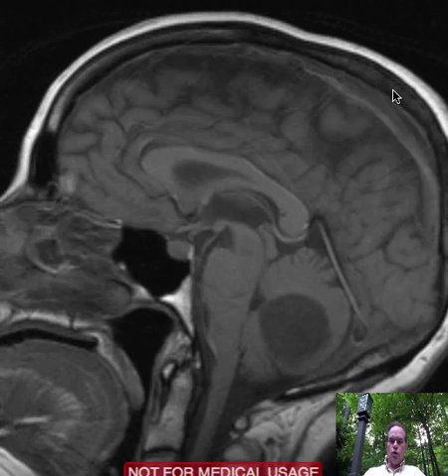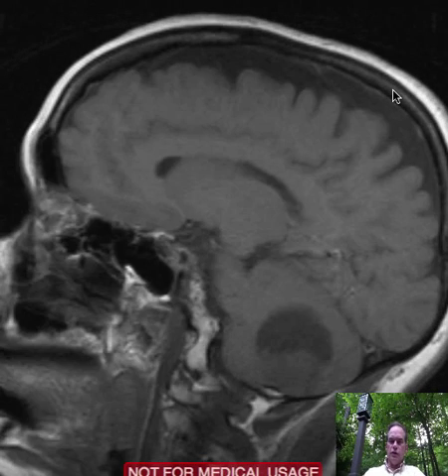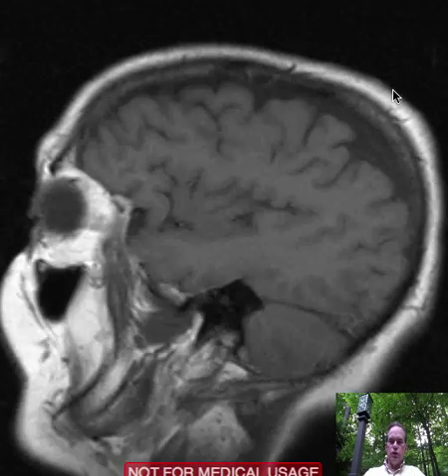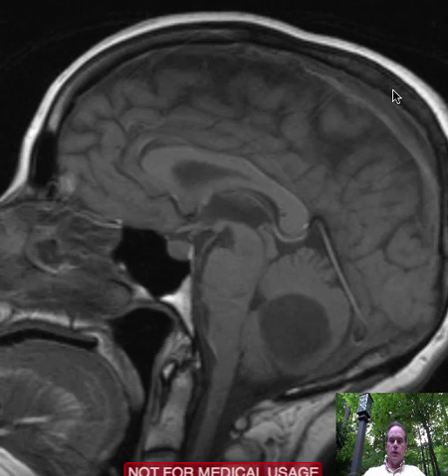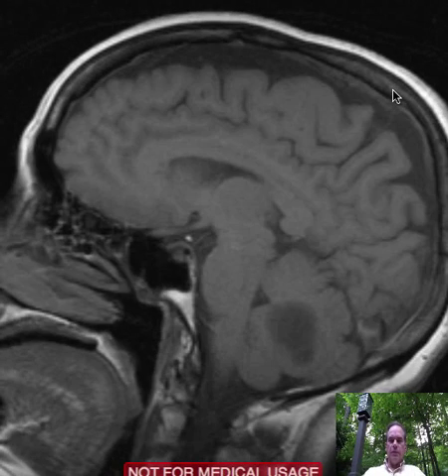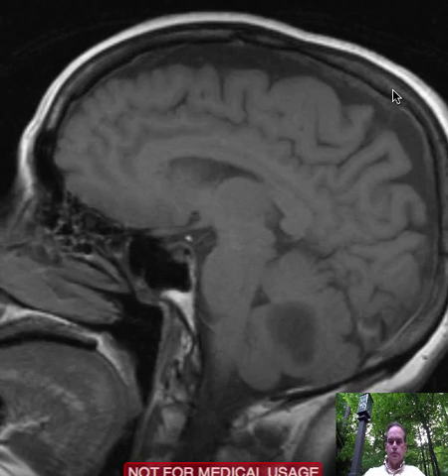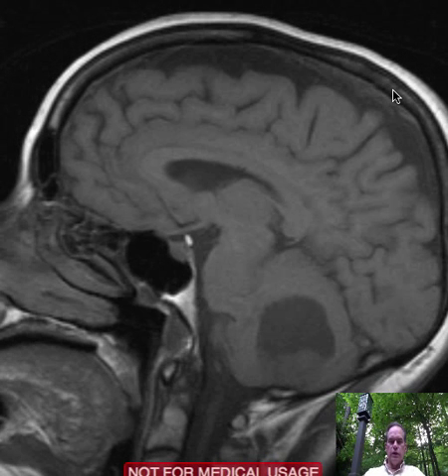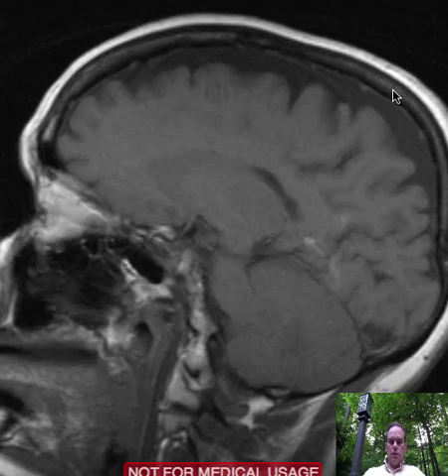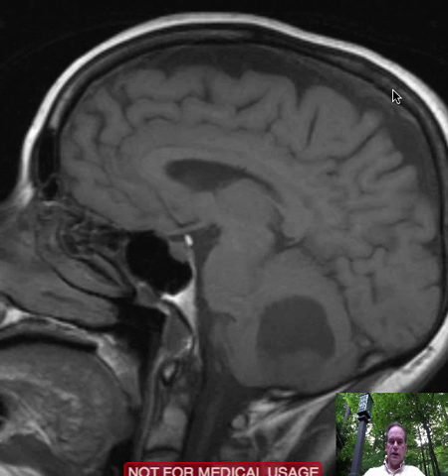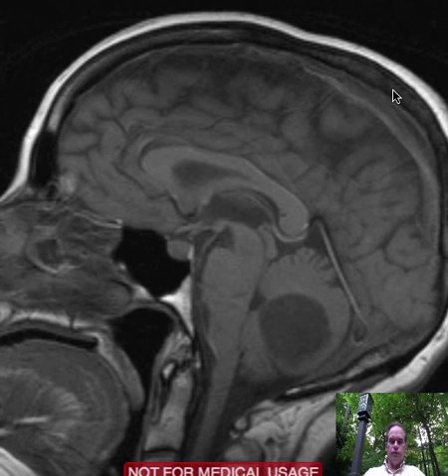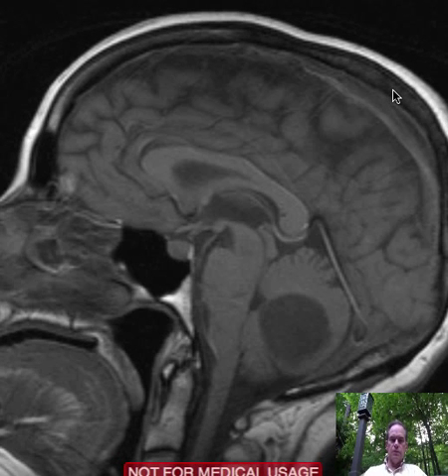This is an overview of the T1 sagittal images. You see an abnormality. Where is it? That's right, it's in the cerebellum. We can characterize that a little more in a few minutes.